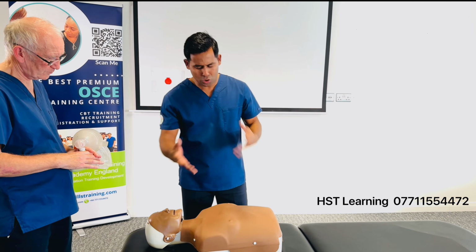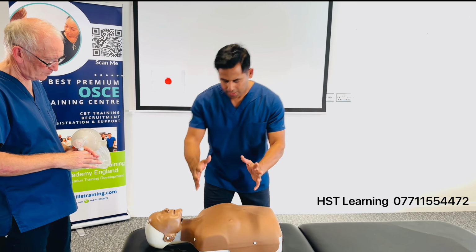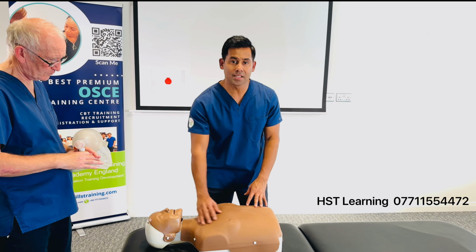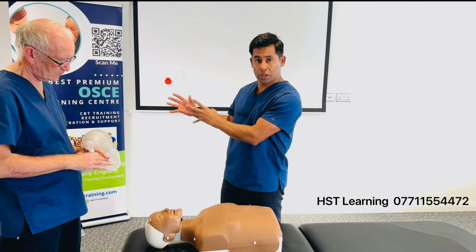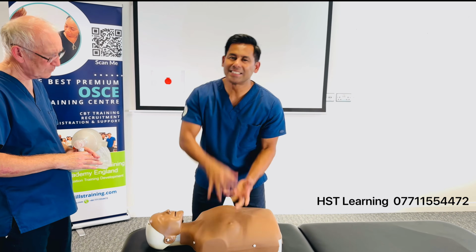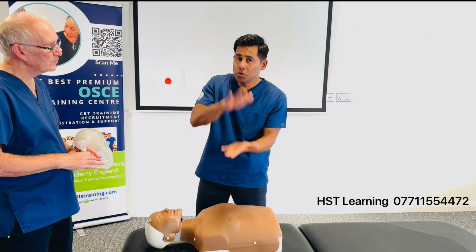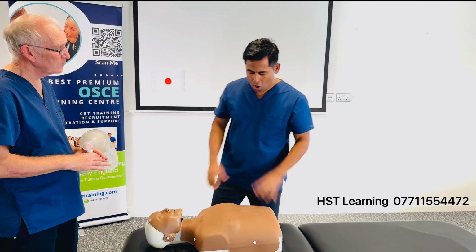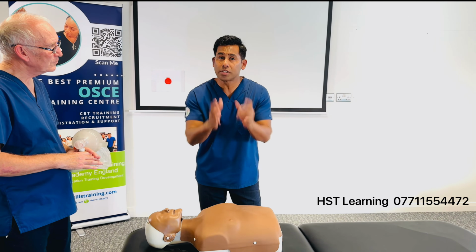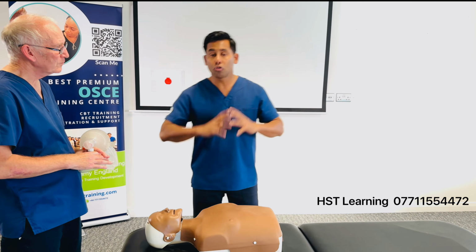What happens naturally in a training situation or simulation exam situation? This dummy is connected to the monitor. There is a little sensor inside here that is connected to the monitor on the computer. The moment you start compressing, 2, 3, 4, it senses the depth. Automatically it measures the rhythm you're picking and the depth. It's normally 5 to 6 centimeters. Anything below 5 centimeters, it will give the red signal. If you get the red signal, that means you're not going deep.